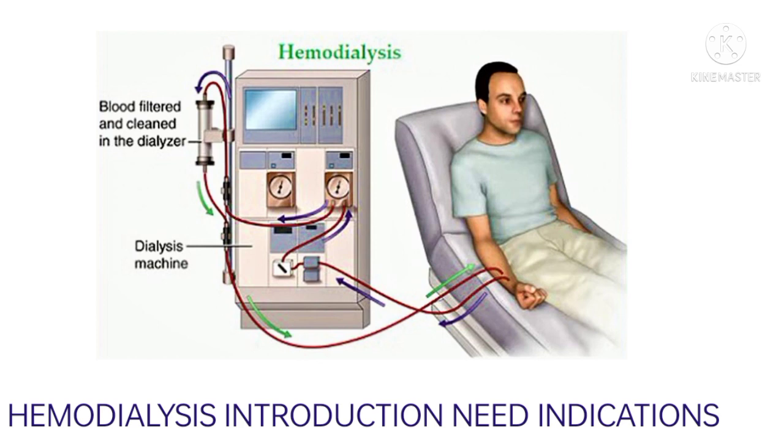Hemodialysis uses a special type of filter to remove excess waste products and water from the body. Peritoneal dialysis uses a fluid that is placed into the patient's stomach cavity through a special plastic tube to remove excess waste products and fluid from the body. Hemodialysis is a medical procedure to remove fluid and waste product from blood and to correct electrolyte imbalance. It is done using a hemodialysis machine and dialyzer, also known as artificial kidney.